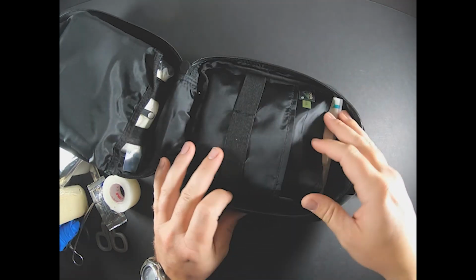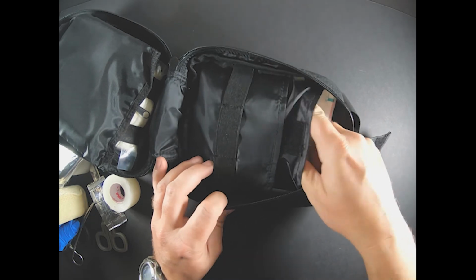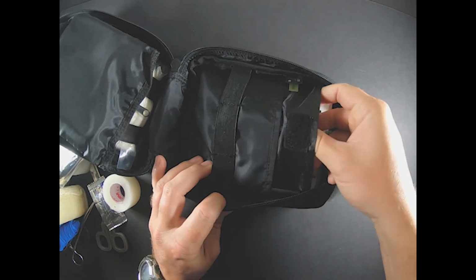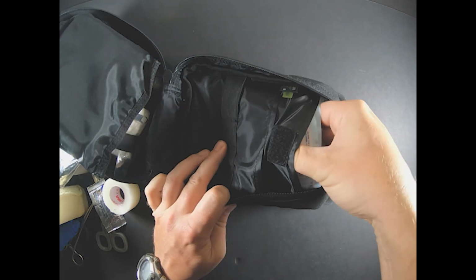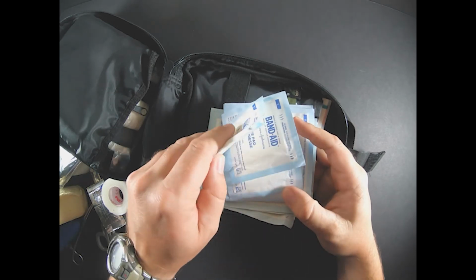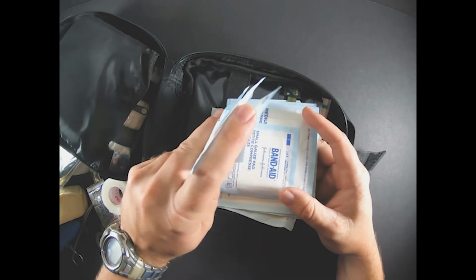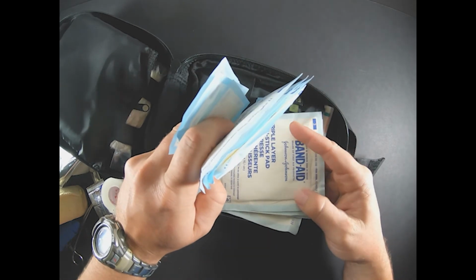Back in this pocket here is empty. And then in the big pocket here, we've got plenty of fun stuff back here. Let me try to grab it all. All right. I've got many different sized gauze pads in here. I go from small to medium. I have some large ones in here.